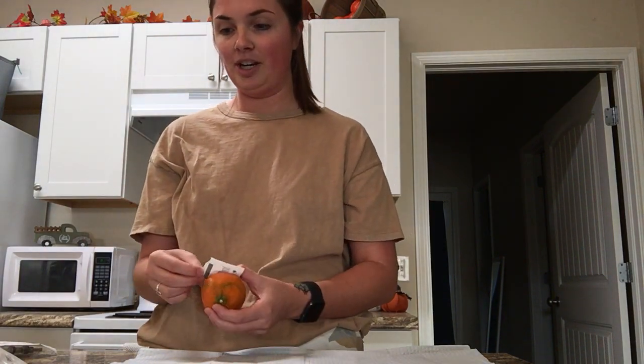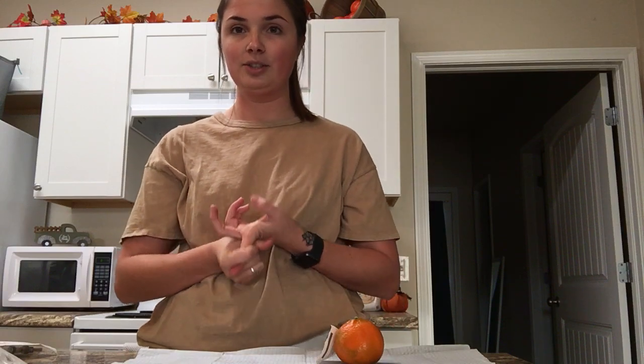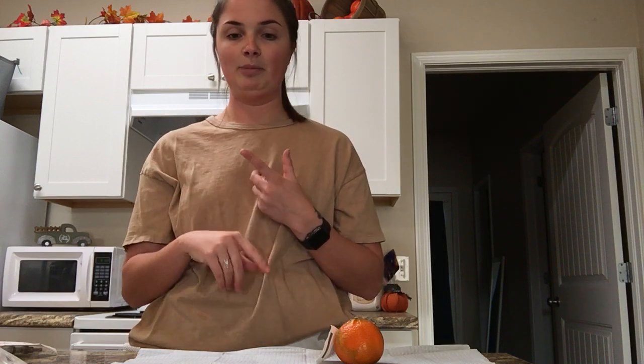I'm going to document that I gave the patient insulin. I'm going to get a nurse to verify that I gave the insulin and the documenting. And then I'm going to take my gloves off, wash my hands, and then make sure the patient has their call light, the bed's lowered all the way, make sure they have everything they need before I leave the room and go do something else.